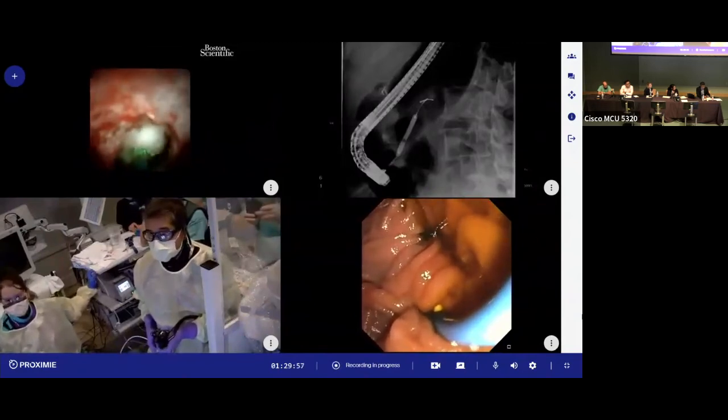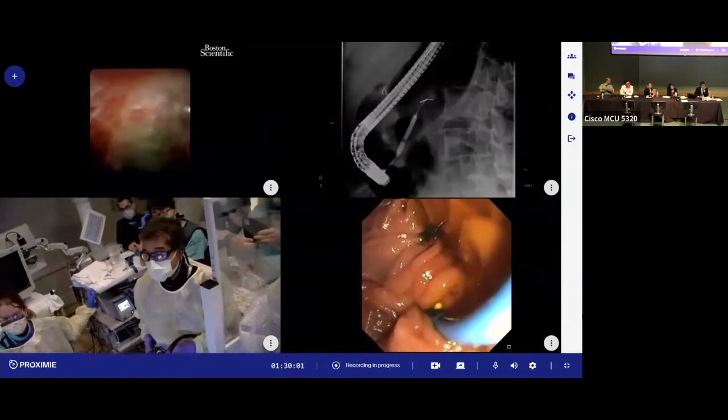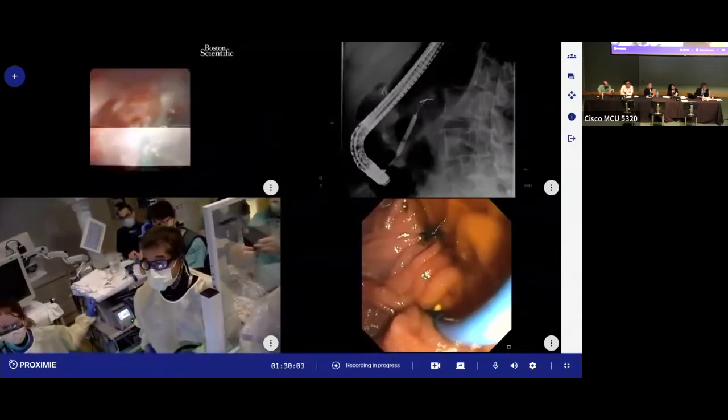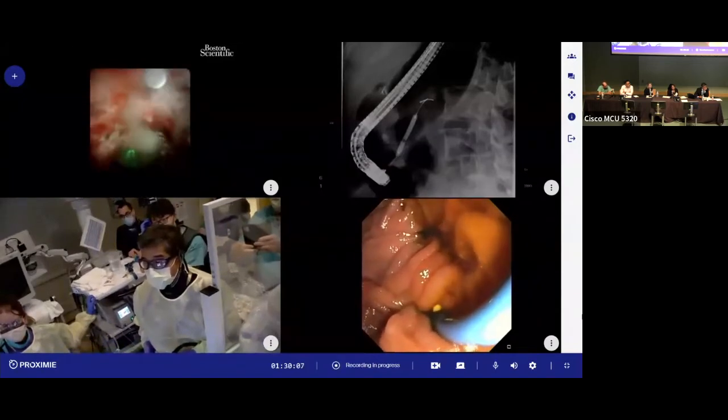And then Sam, I'd love to hear from you and your opinion regarding this technique, but also what you think about SBAL in this setting. I'll go ahead and ask that question before the audience or the moderators would.